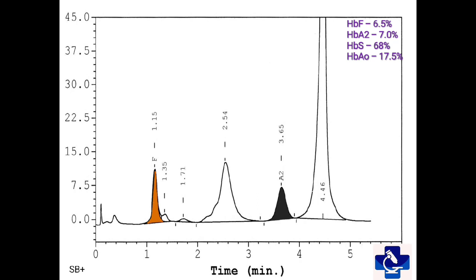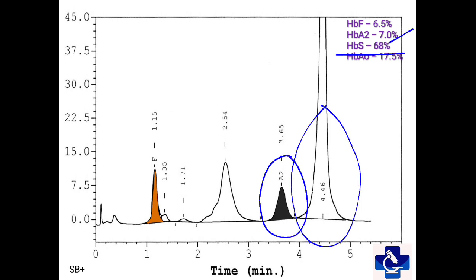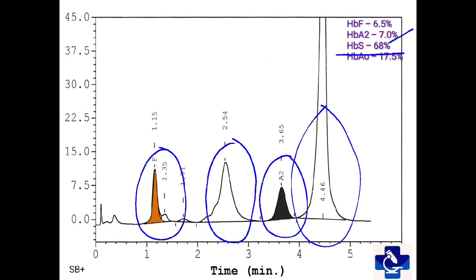In this graph, we have HbS of around 68%. HbA2 is quite raised at near about 7%, hemoglobin F is around 6.5%, and we have adult hemoglobin A0 of around 17.5%. Now, in sickle homozygous, hemoglobin A0 is not produced. So there are two scenarios: this patient may have sickle and beta-plus thalassemia — a double heterozygote — or the patient may have had recent multiple blood transfusions.